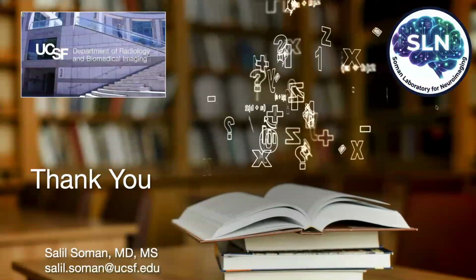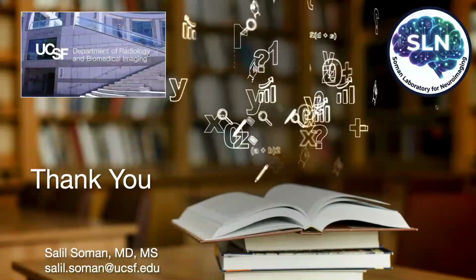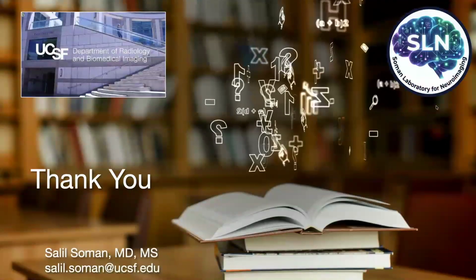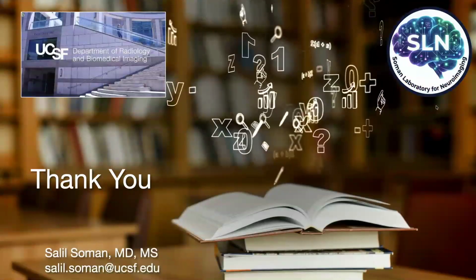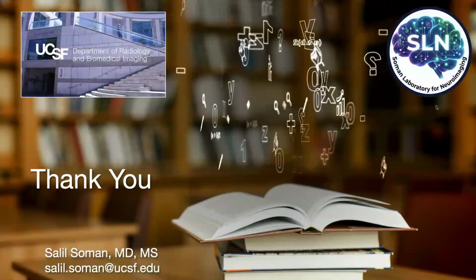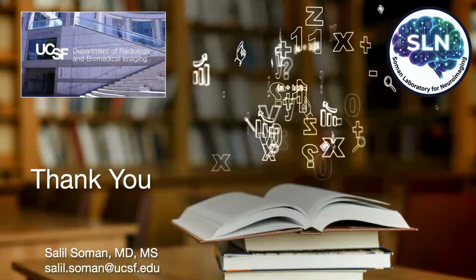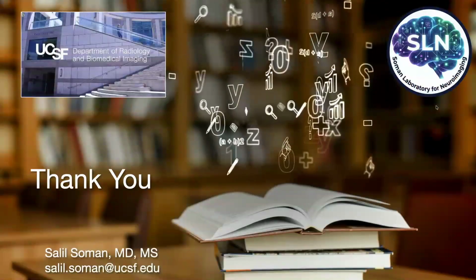It sounds like we now have all the MRs here, right? Are now programmed. Is that correct? So we have a neurodegeneration protocol that can give us one type automatically. It's only on our 3T scanners, but both for GE and Siemens, all of our 3T scanners are capable. If you order neurodegeneration, then it'll definitely be in there, a version of it.